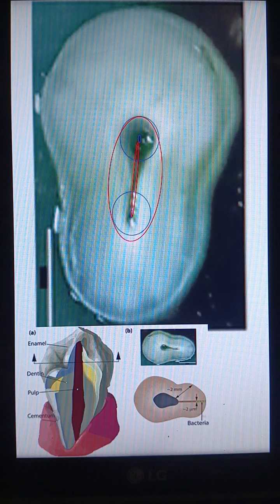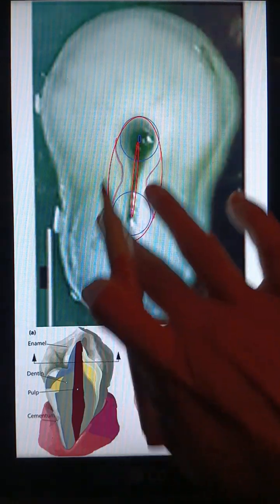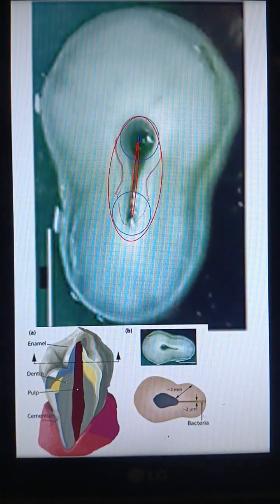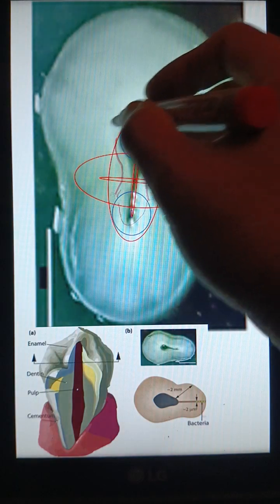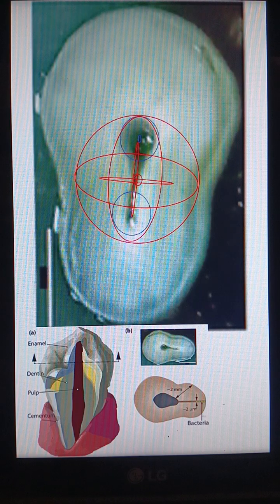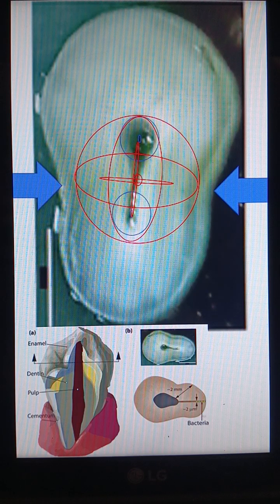This is how the final preparation should be — you should be able to get that shape and come in along the isthmus without making it too wide. Do you think this can be attained with a rotary instrument? With a rotary instrument you will get a round shape, but if you're using a large rotary instrument you'll go around in circumferential movement and cut all around. What you've attained is a very nice radiograph, but you've cut away unnecessarily a lot, causing weakening of the root surface — and this is very prominent in premolars. I do see a lot of fractures because of rotary instrumentation.